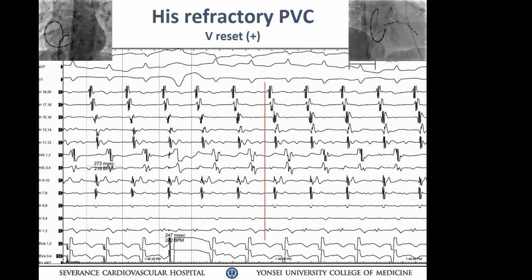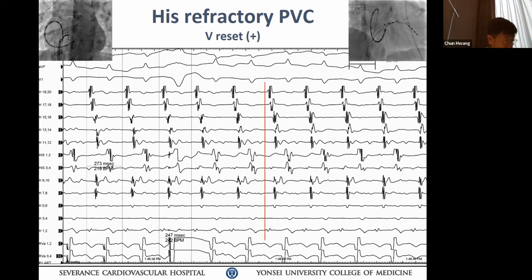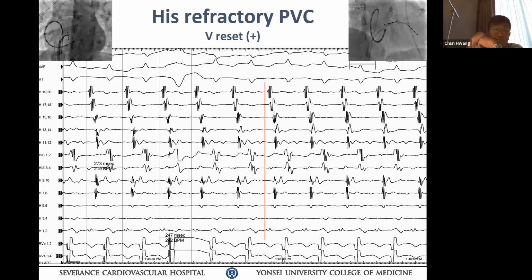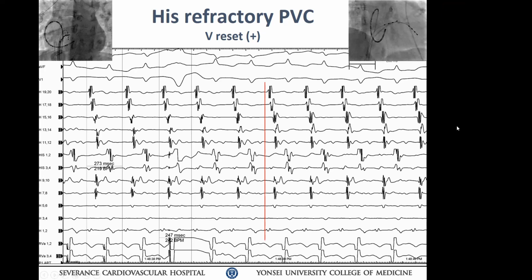나중에 결국은 석세스한 사이트는 MCV 오스였는데요. 완전 옆으로 누워가지고 리가멘트 마샬 쪽으로 돌아가는 바이패스트가 됐고요. Yeah. 근데 이 사람이 그 전에 너무 많이 어블레이션해서 CS 오스가 캐타타 진입이 전혀 안 돼갖고 나중에 결국은 그냥 쑤셔 넣어가지고 매핑이 가능했었는데. 그러니까 그 서머리가 뭐냐, 얘가 얘기하는 게 뭐냐면은 디크리멘탈 프로퍼티도 있었습니다.